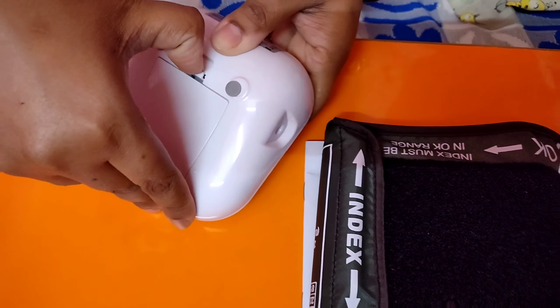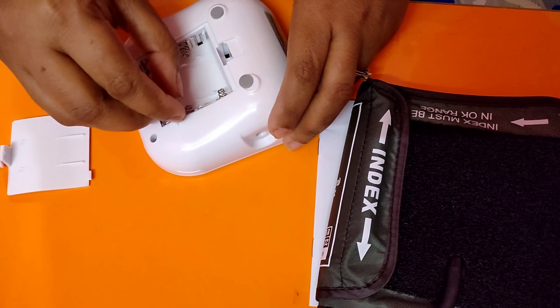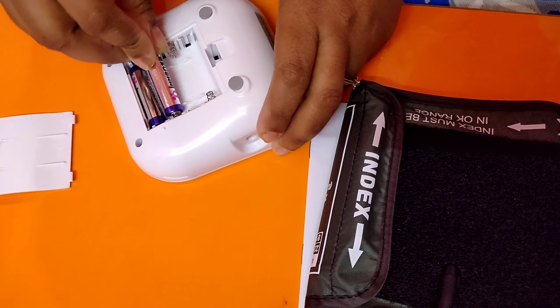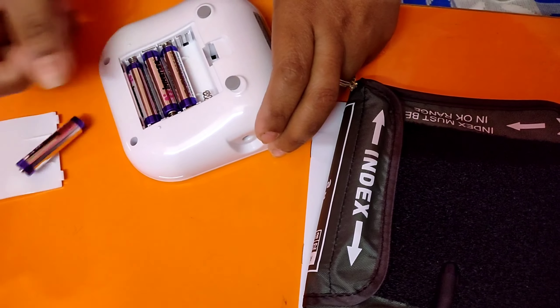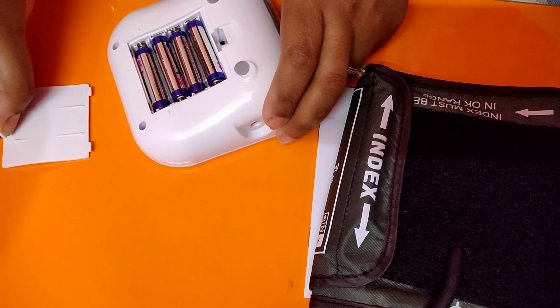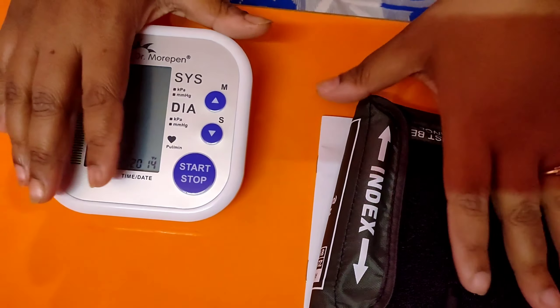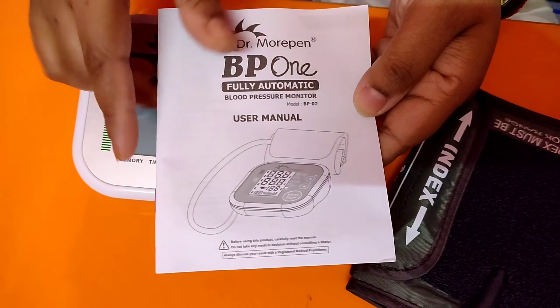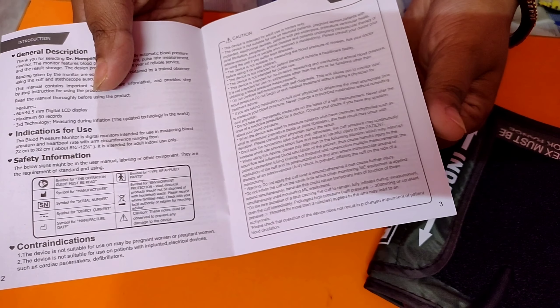I am going to insert the battery in the machine to set it up further. When using the machine for the very first time, one must refer to the user manual. In the user manual, a detailed guideline has been given on how to use the machine along with its detailed specifications.